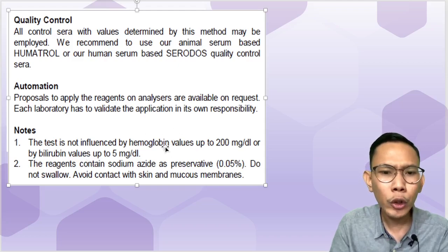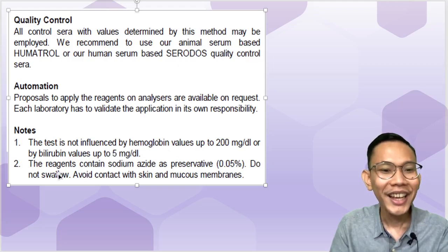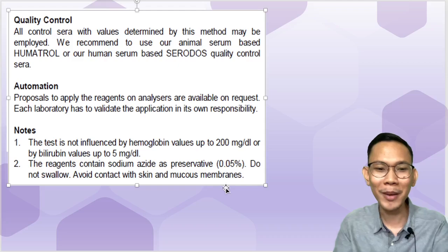Pag normal ang hemoglobin ng pasyente natin, ayos lang. Pag normal ang bilirubin or mababa from 5, ayos lang. But more than 200 or more than 5, it's not okay. The reagent contain your sodium azide as preservative. Do not swallow, avoid contact with skin and mucous membrane.